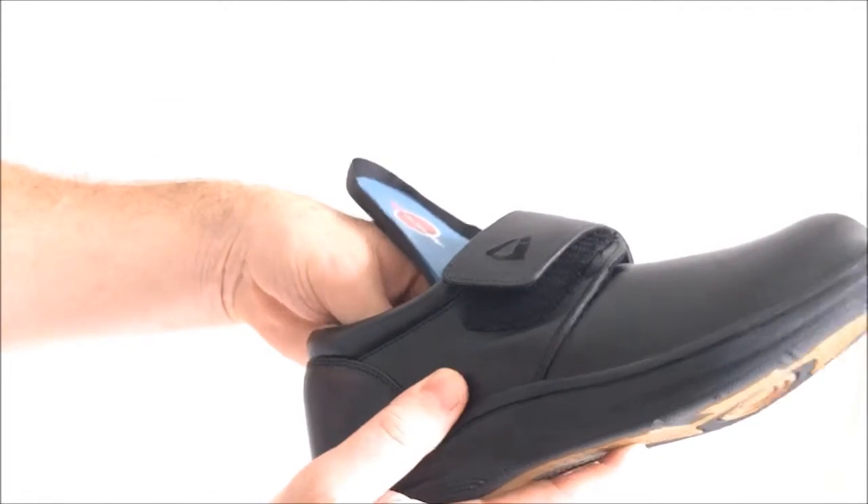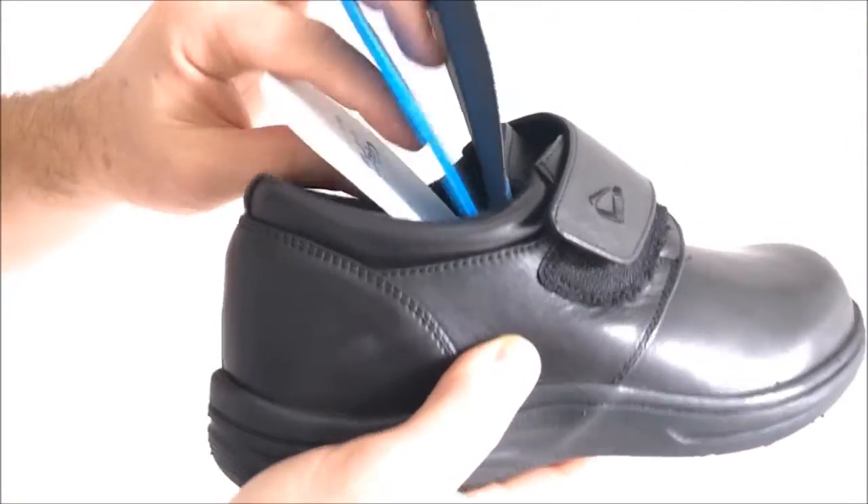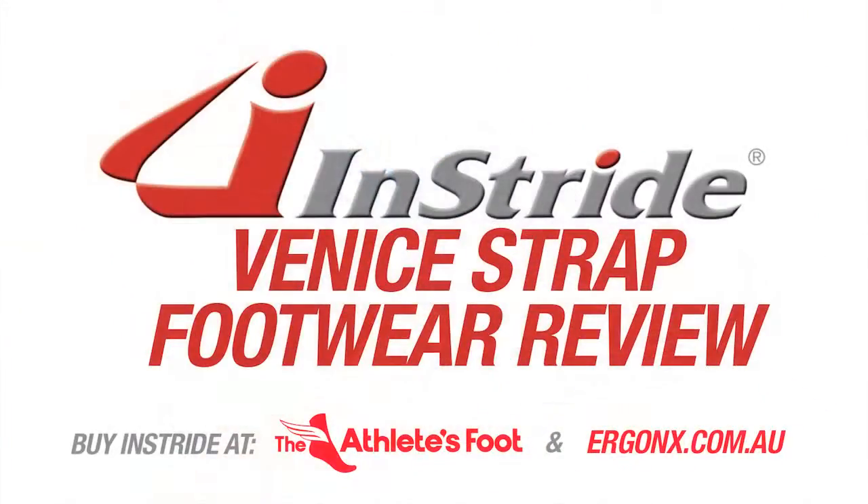The custom fit system provides up to three levels of adjustment which will help to accommodate even the hardest to fit feet. When we combine all of the features of the Instride Venice, it's easy to see how the Instride Venice would benefit your diabetic or difficult to fit customers.